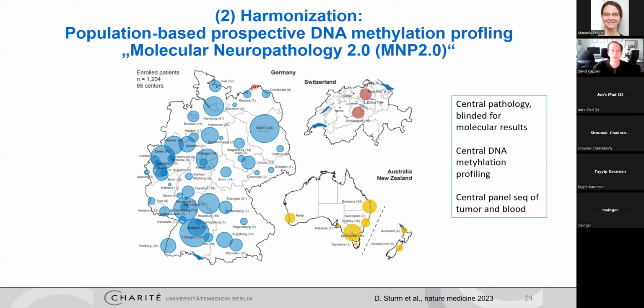Now coming to the last third, which will be DNA methylation for the classification of non-CNS tumors. There have been various lines of development, but I think the two main lines that I would like to briefly show are, on the one hand, organ classifiers or organ group classifiers, or tumor group classifiers, as I would call them. So there has been the publication of CNS tumors, which has now steadily been updated. Then there has been a publication on sarcomas. This is also just about to be updated for the first time, to a sarcoma version 2 classifier.